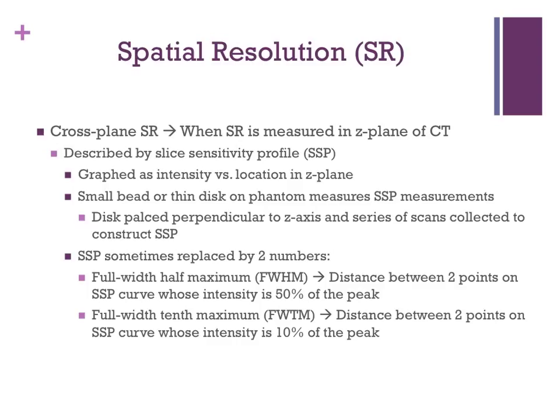And the other number is the full width tenth maximum, FWTM, and this is the distance between 2 points on the SSP curve whose intensity is 10% of the peak.